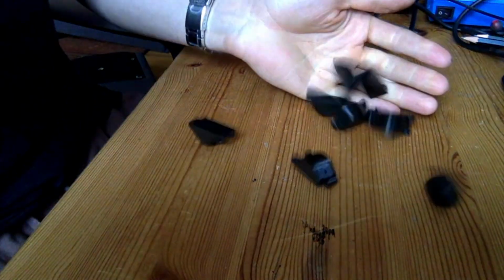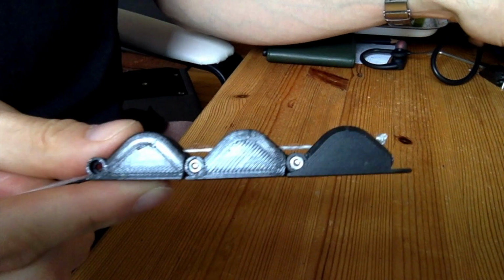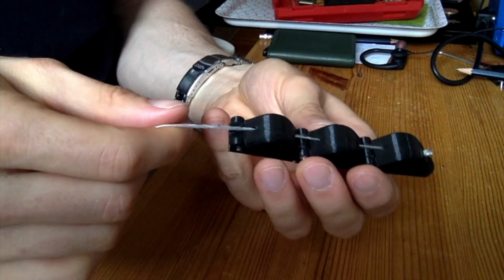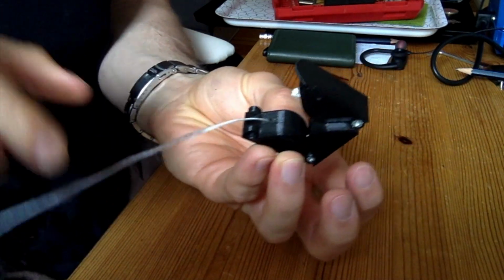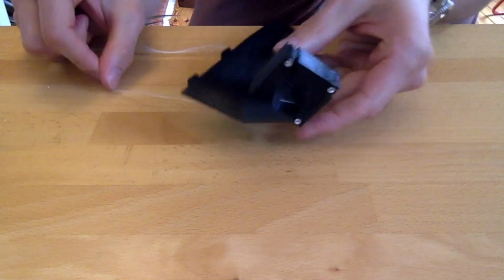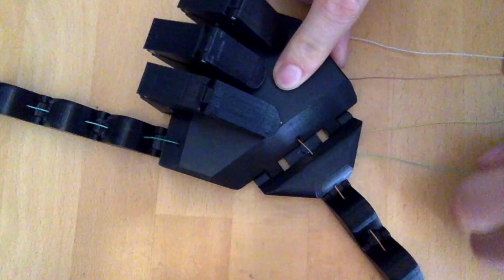I've gone ahead and 3D printed the segments, which attach together and are secured with M2 bolts as planned. You may have noticed some small holes going through the finger segments. This is because the motion of the fingers will be controlled with a piece of cord threaded through the segments. When the cord is pulled, the joints of the finger bend. I've gone ahead and attached all the fingers and the motion is exactly as we hoped.